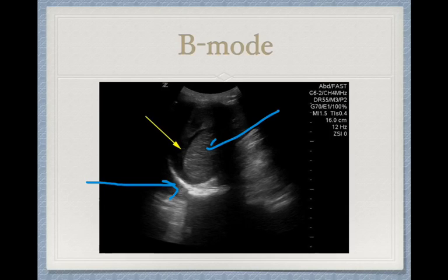And then right here is a spleen, and that is more on the spectrum of an isoechoic, so along that gray scale. Here again is a rib. That's going to be a pretty strong reflector, so behind it you're going to get some shadowing, which again is not going to display any return sound to the machine. All right, so that's an example of that.